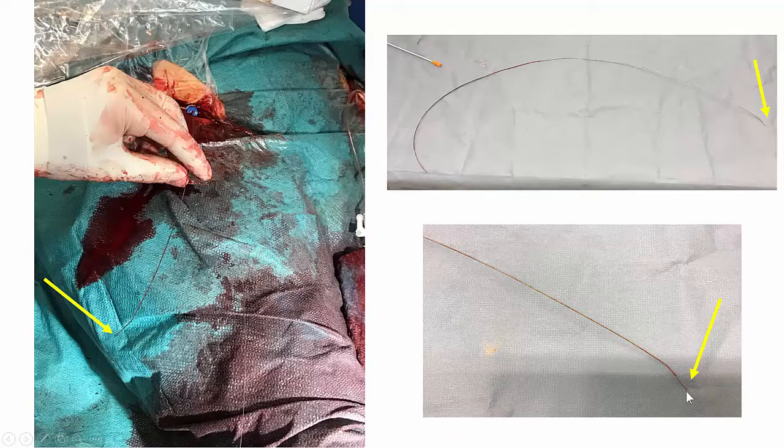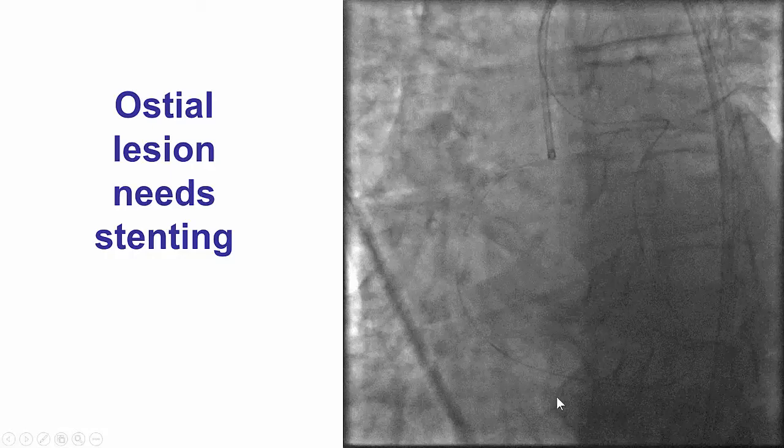It is still unclear why the fracture happened, but the most likely mechanism was that the balloon shaft was kinked, and then during attempts to advance or retract, that kinking point became weak and finally gave out and fractured. But once again, we had a happy ending. We retrieved both fragments of the fractured balloon catheter.